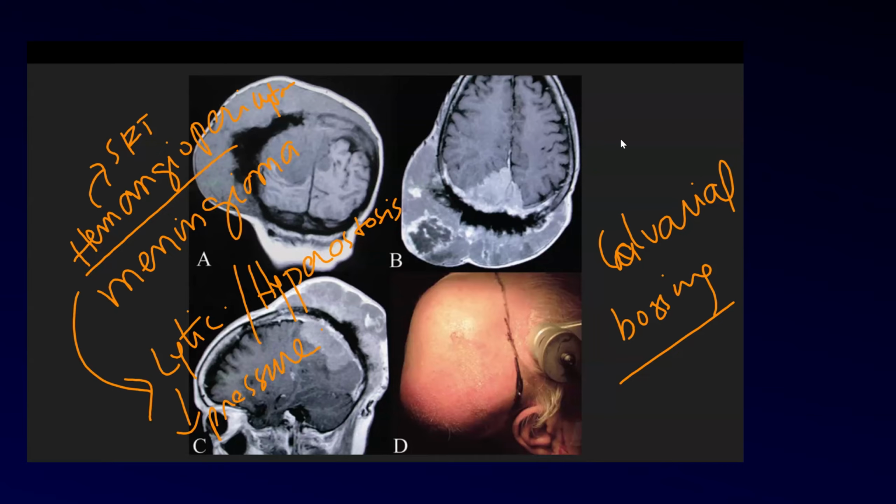So CSF cleft sign, Dr. Sophia, sometimes hemangiopericytoma can have CSF cleft signs, and I am not sure about the mother-in-law sign. Do you mean the contrast delay? Let's move to the next slide.